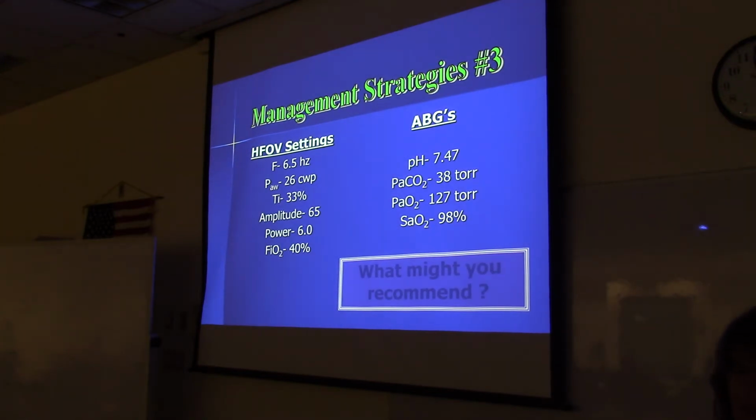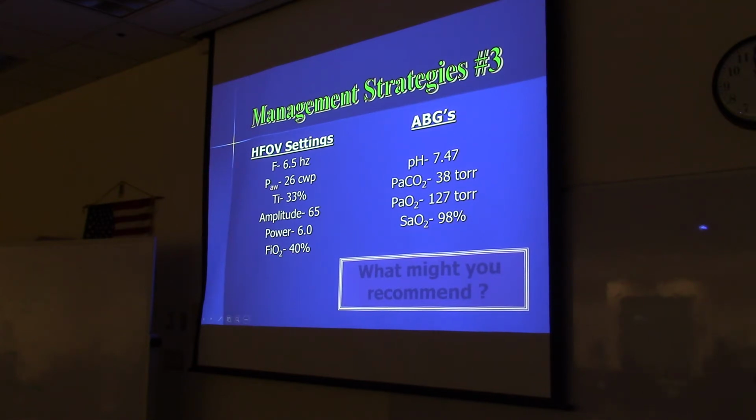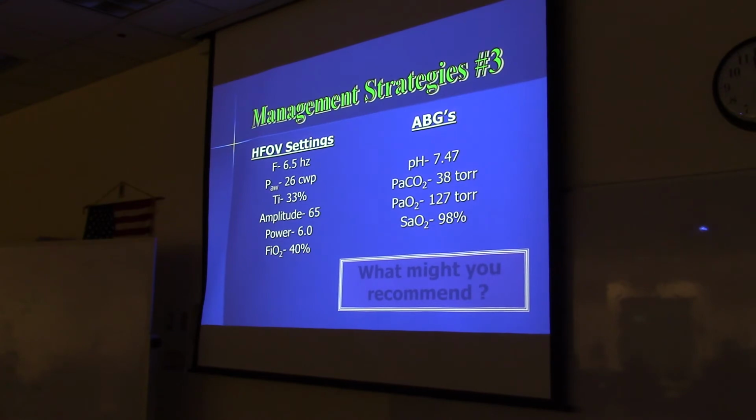Here are some settings, good blood gases, what do you recommend? And this is weaning, so I don't expect you to know all the ways to wean the patient, so we can skip this. Whatever you say.